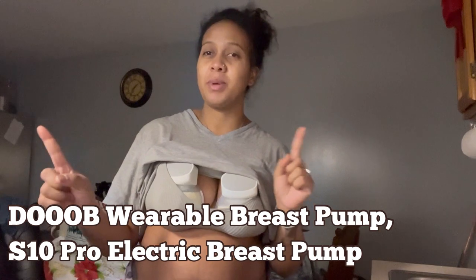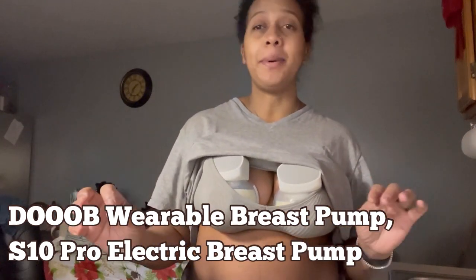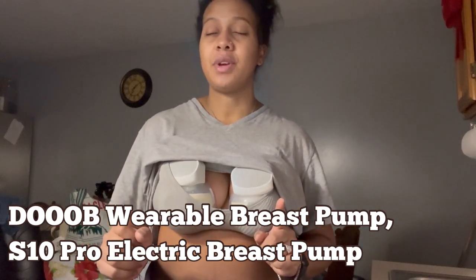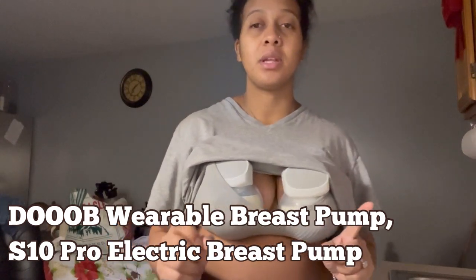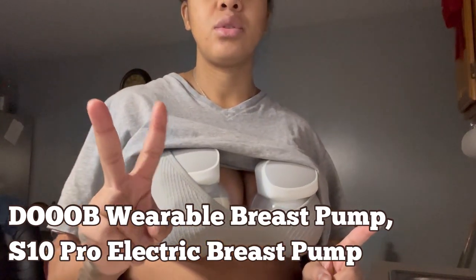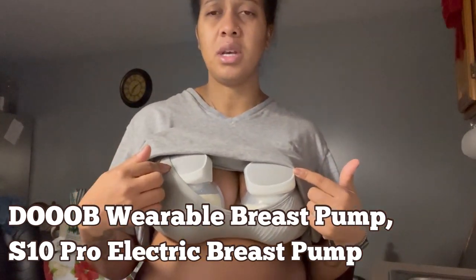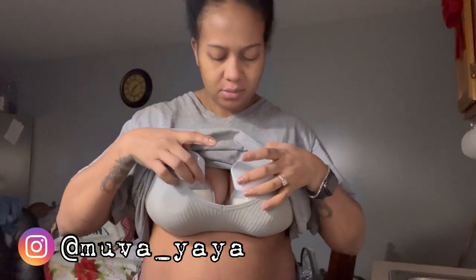You know how they say pumping ain't easy — pumping is NOT easy. It's about 7 or 5 a.m., the baby just went back to sleep. I did two power pump sessions: I did 20 minutes, then took a break while I fed the baby, and we are 14 minutes in and we're gonna stop.